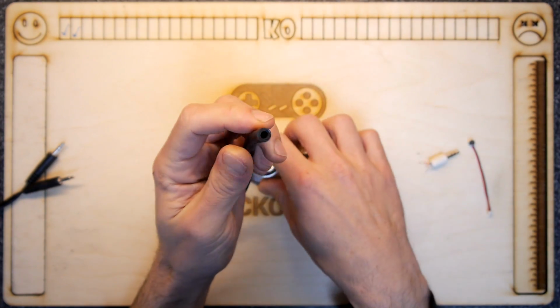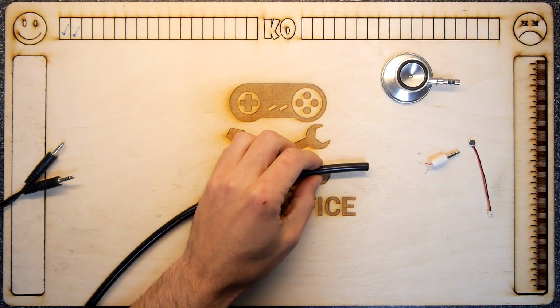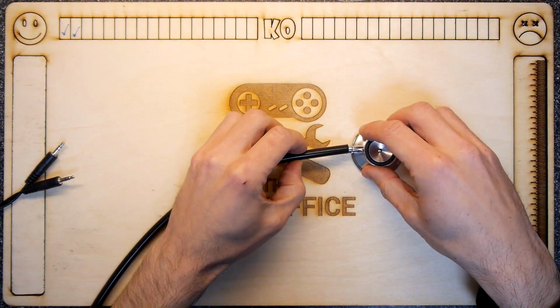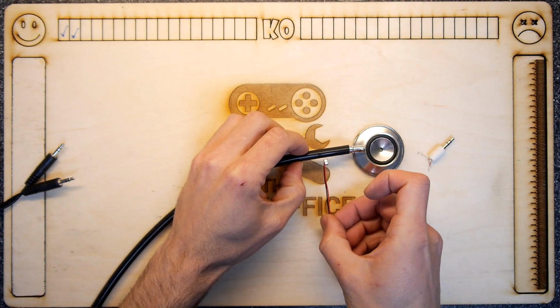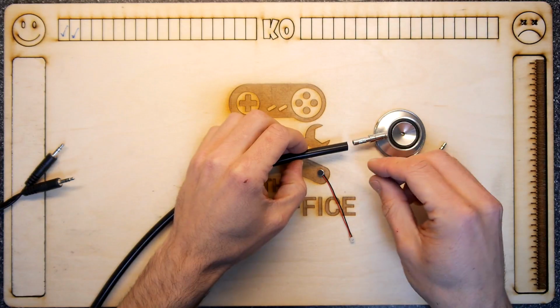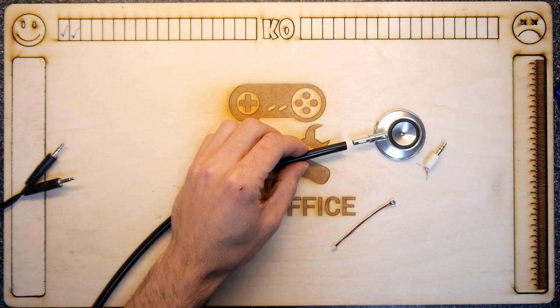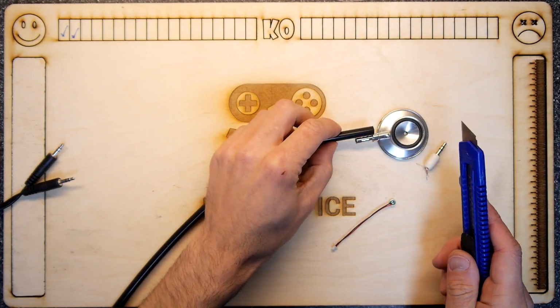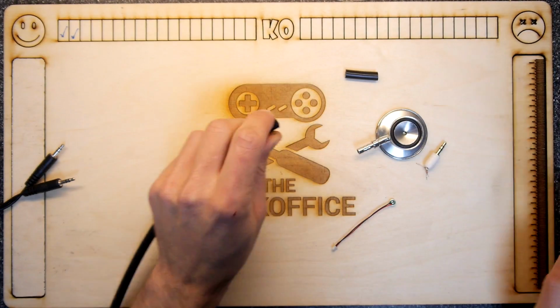I mean, this is 4 millimeters. I think I'll be able to jam it on. All you've got to do is cut a length slightly longer than that, basically. In fact, you can decide how long you want it. I'm just going to go for about an inch. An inch should do.